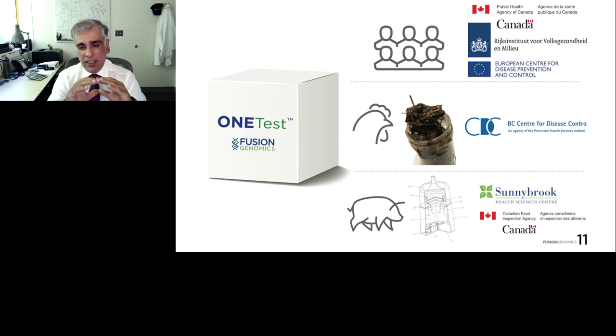They are designed against all the known evolutionary lineages across all known species that we have information for. So what does that mean? When we have an assay for flu, it would work on humans, it would work on birds, and it would work on swine or pigs, or for that matter any other organism, because the probes are derived to capture evolutionary lineage.